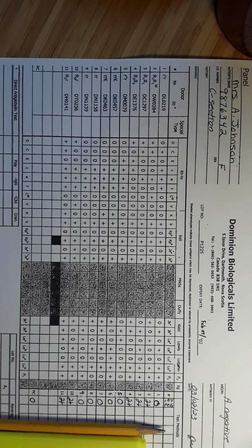Now, typically on someone that's female, childbearing age, we would phone and see if they received Rh immune globulin, because that is anti-D, and that can be passively transferred obviously into her plasma and result in her having a positive screen. But for the purposes of this demonstration, we'll assume that that was not done, and they proceeded to do a panel, a full panel.